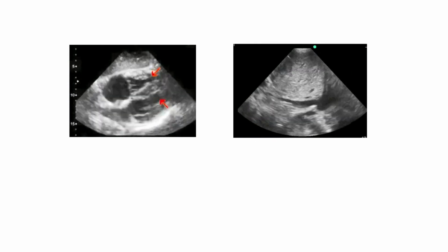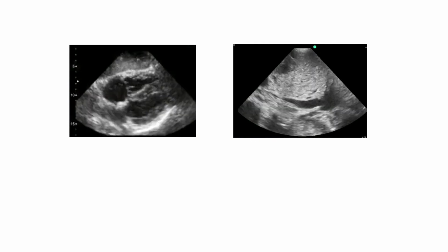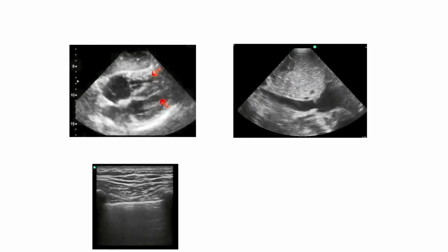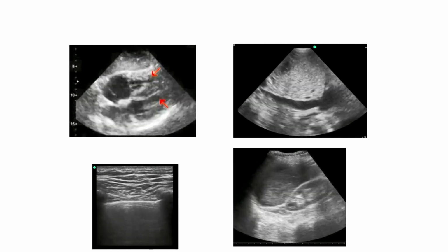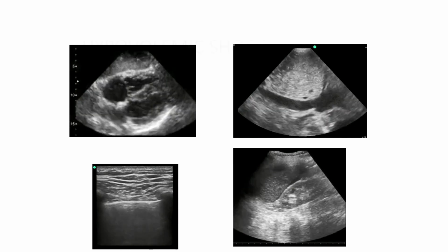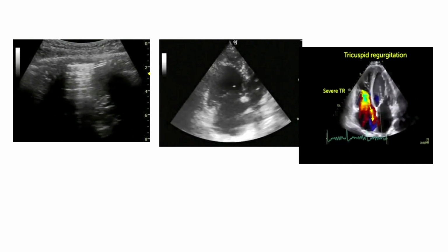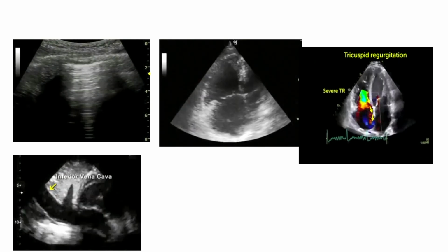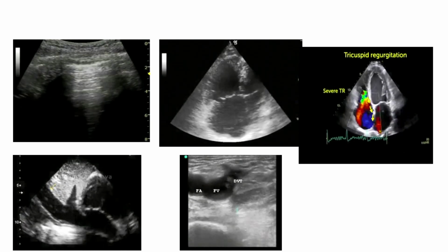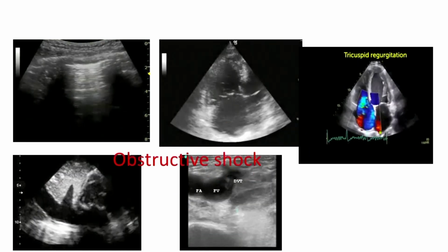Second, we see a rapidly contracting heart, an IVC which appears collapsible with every breath, dry lungs and free fluid within the abdomen. Possibility: hypovolemic shock. Give fluids here. A third combination: dry lungs but signs of right heart dysfunction, a dilated right heart, distended IVC, and a DVT scan which is positive. This is obstructive shock.